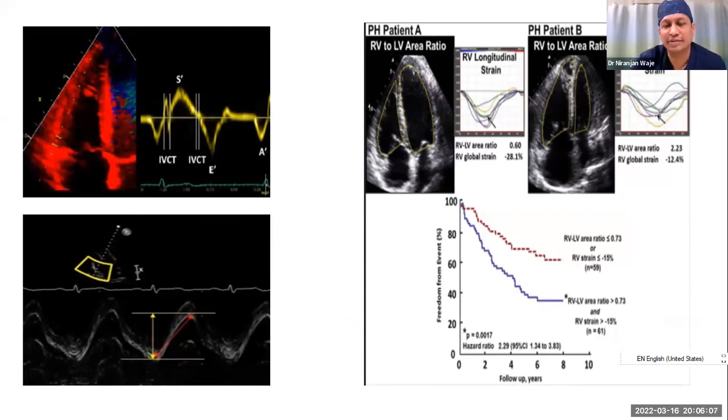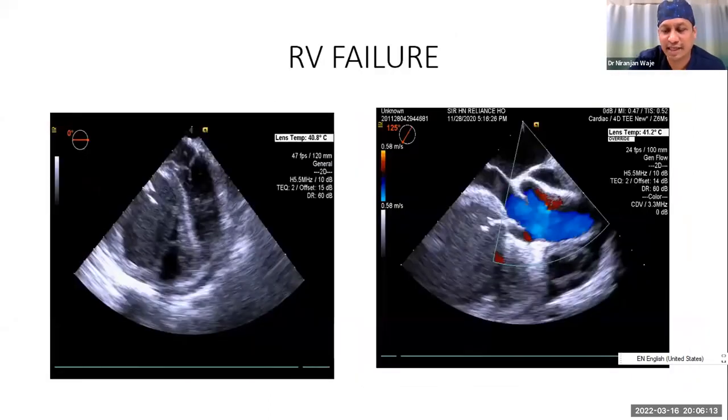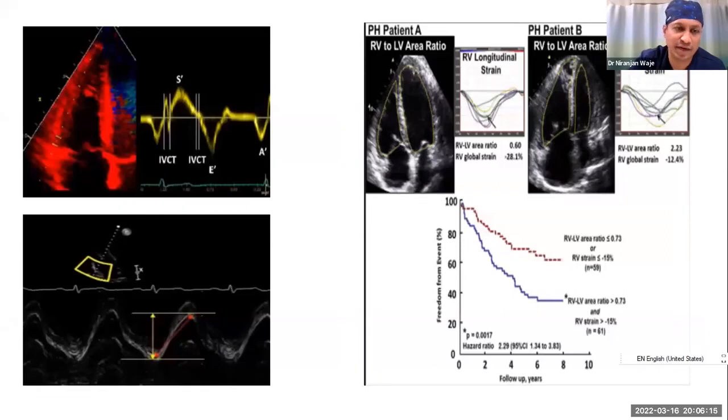This was a common scenario for even those people managing liver transplants. So this is the next slide. The earlier slide was a qualitative assessment of the RV. This is a quantitative assessment of the RV.